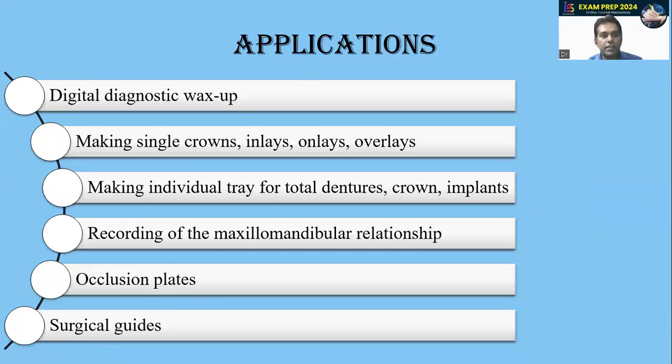Now, regarding application, they are used for digital diagnostic wax-up, making single crowns, inlays, onlays, and overlays, making individual trays for total dentures, crowns, and implants, recording of maxillomandibular relationship, fabrication of occlusal plates, and surgical guides.